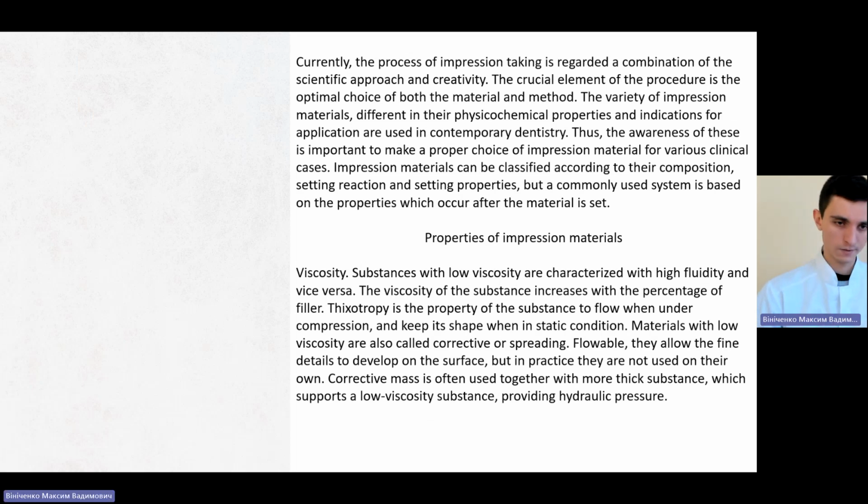Currently, the process of impression taking is regarded as a combination of the scientific approach and creativity. The crucial element of the procedure is the optimal choice of both the material and method. A variety of impression materials, different in their physicochemical properties and indications for application, are used in contemporary dentistry. Thus, awareness of this is important to make a proper choice of impression material for various clinical cases.